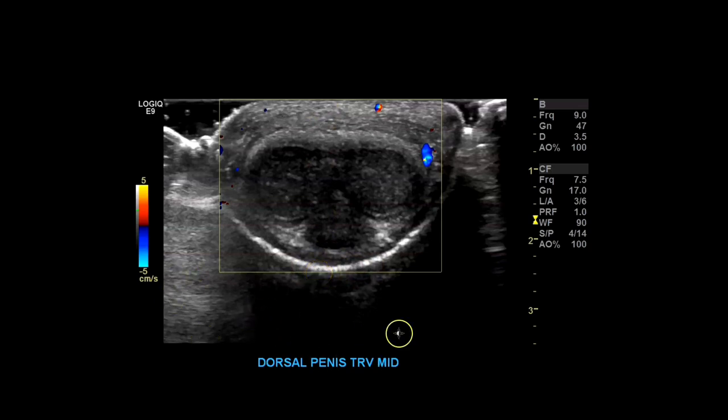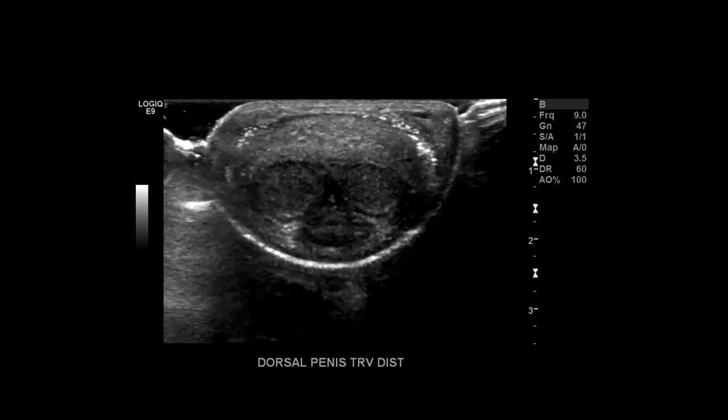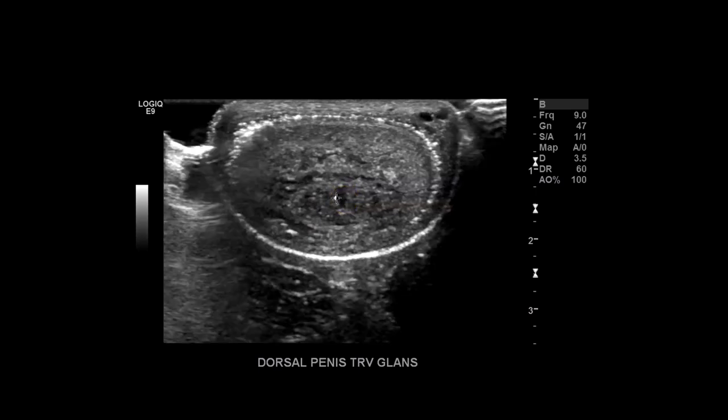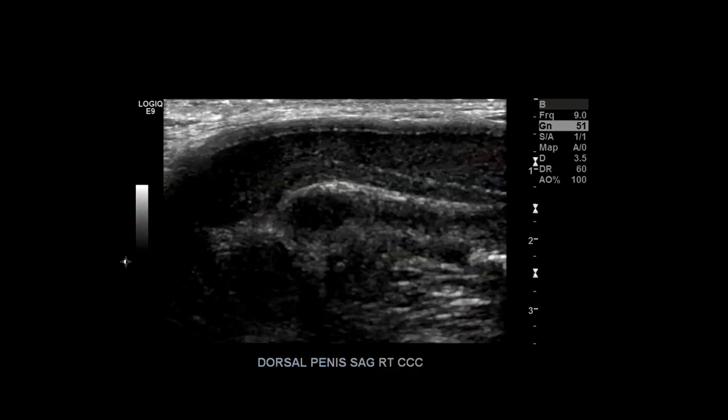Then distal — distal is towards the glans or the penis head. Again corpus cavernosum and corpus spongiosum. You can start seeing some of the more echogenic glans come into play. This patient was uncircumcised, so you can see these echogenic dots — that's air under the foreskin. For dorsal penis transverse distal, add color doppler again. You want to make sure the corpus cavernosum are intact with no abnormal collections or hypoechoic areas suggesting a penile fracture. At the glans you can see the beginning of the urethra, which becomes the meatus.